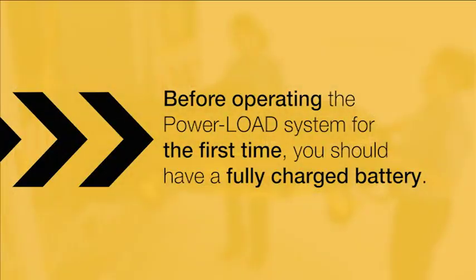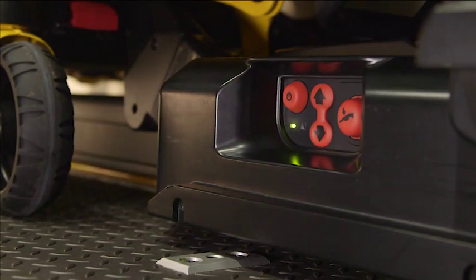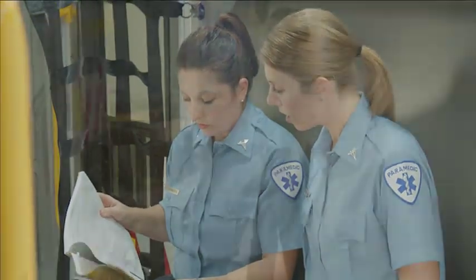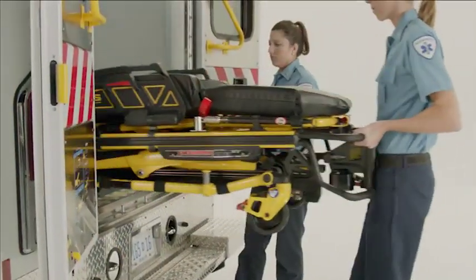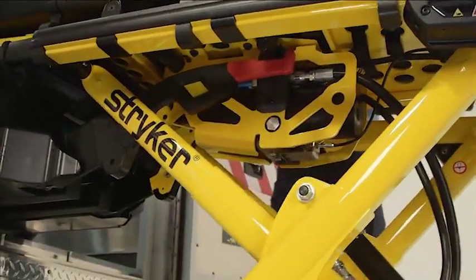Before you can operate the Power Load system for the first time, you should have a fully charged battery. Ensure that the trolley power is turned on by checking the Power Load control panel as referenced in the operations and maintenance manual. You should practice using the Power Load system with an unoccupied cot before attempting to operate with a patient.